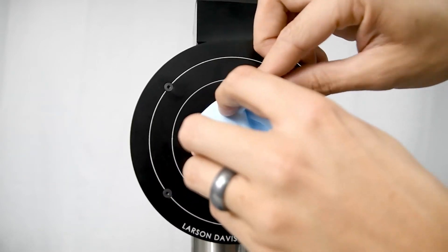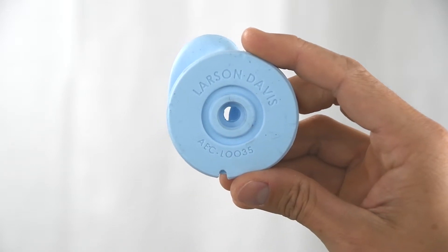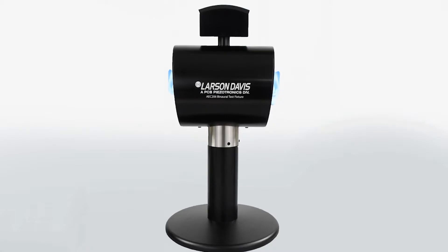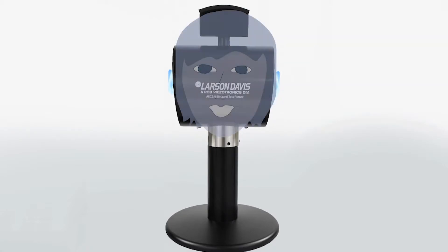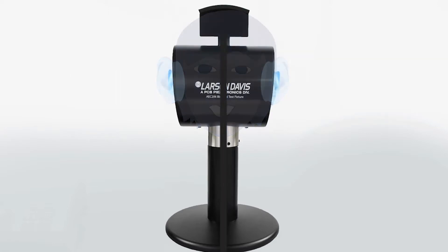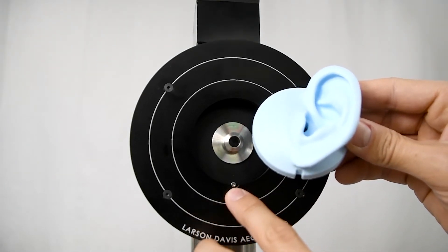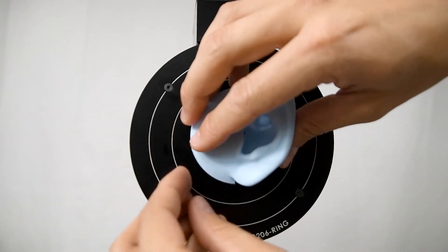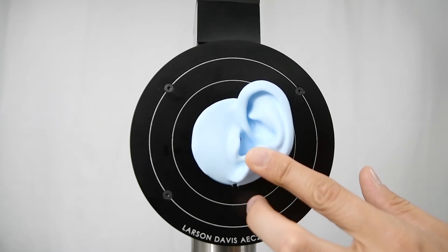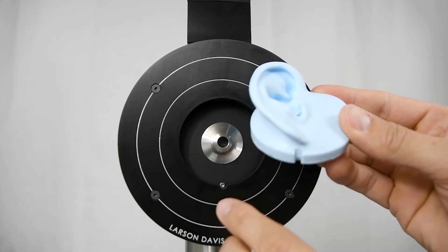Last, we are going to remount the pinna. The left pinna is indicated with the L in the product name and the right with an R in the product name. Whenever we talk about left and right, think about the AEC-206 as a head where the logo is the face — so it is the device's left and right, not yours. Take the left pinna and push it into place on the left side of the head. If done correctly, the notch at the bottom of the pinna and the notch in the alignment ring will form a circle. Then repeat this process for the right side, aligning the notch at the bottom of the pinna with the alignment screw on the head.